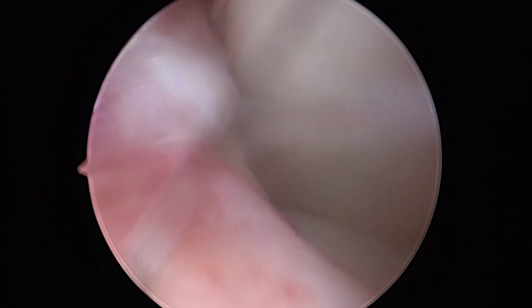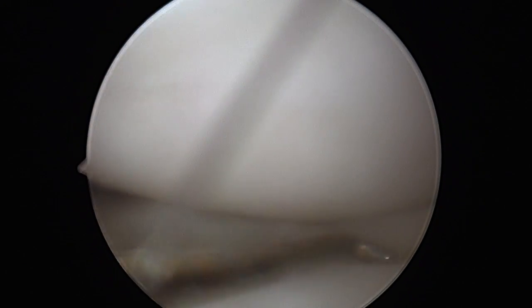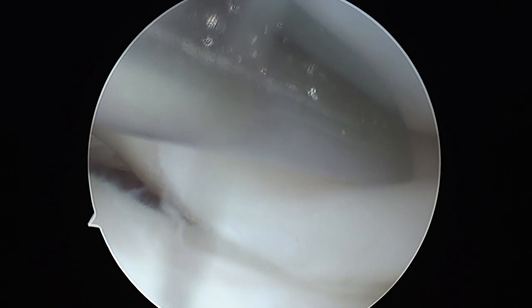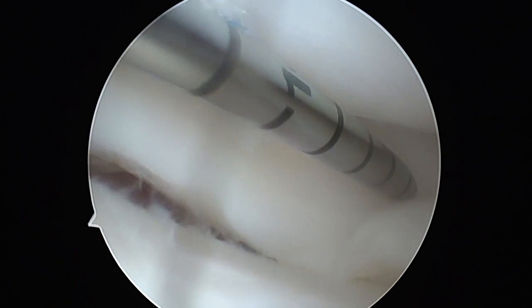An LP needle is used to make the portal. It's then made and dilated using an artery forceps. The meniscus is reduced using a probe. The sleeve is then introduced and the fast-fix anchor passed through it.